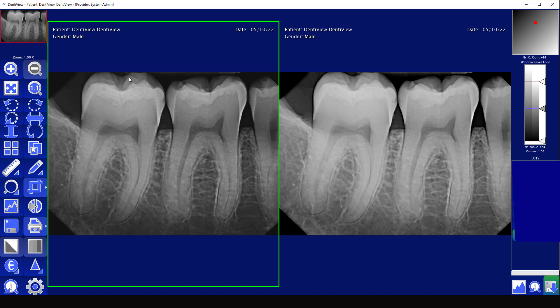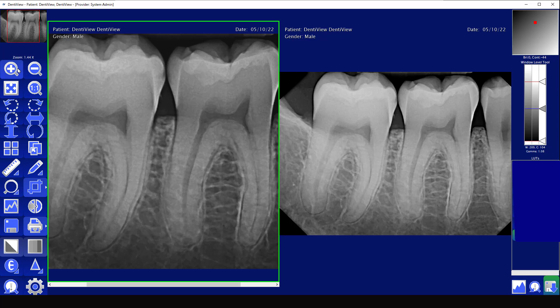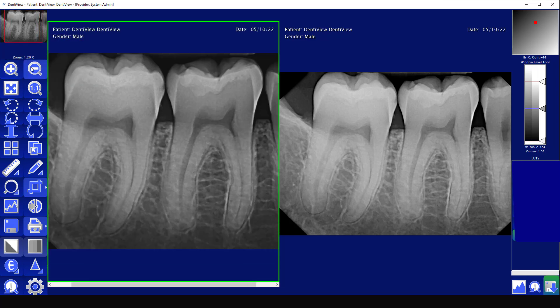Next are the zoom in and zoom out buttons. You can zoom in or out on an image using these controls. Then you have the full screen button. As you'll notice, when you hover over each button it gives you a brief description of what it does.